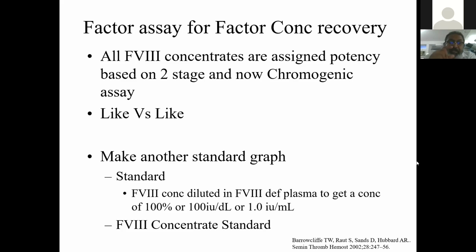Now with the factor VIII deficient plasma, which has been spiked with factor VIII concentrate to a level of 100%, you have a normal standard plasma where factor VIII has made the factor deficient plasma 100%. Now use that to create the standard graph, that is 1 in 10, 1 in 20, 1 in 40 dilution, and then you assay the patient, you find that this particular problem with the one-stage factor assay gets eliminated.